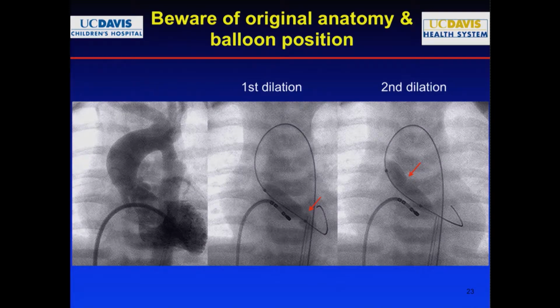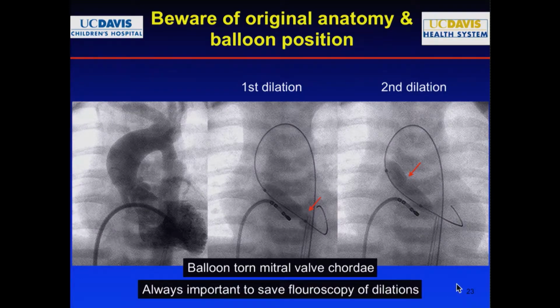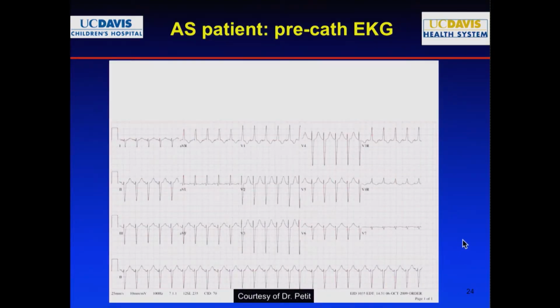All right, so that's why you always have to remember to keep the fluoroscopy. Sometimes people would say, I did it exactly the way I was supposed to do it, and I don't know what happened. Well, if you don't save your fluoroscopy, you won't know what you did. So it's always a good thing to save everything that you do so that you can go back and review it and see what went wrong. You can always learn something from it. So I always save my fluoroscopy. I know that doesn't happen too often.